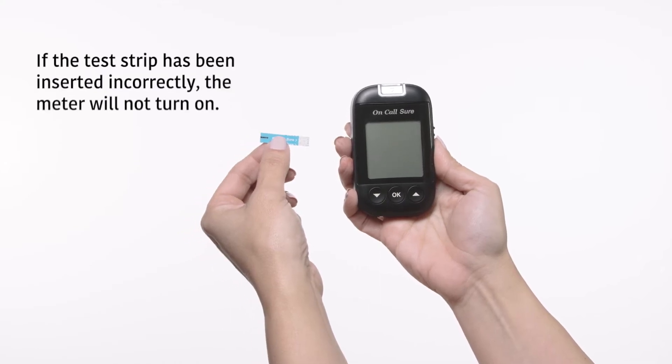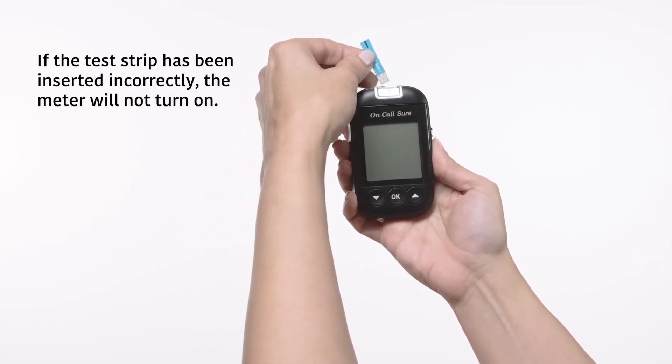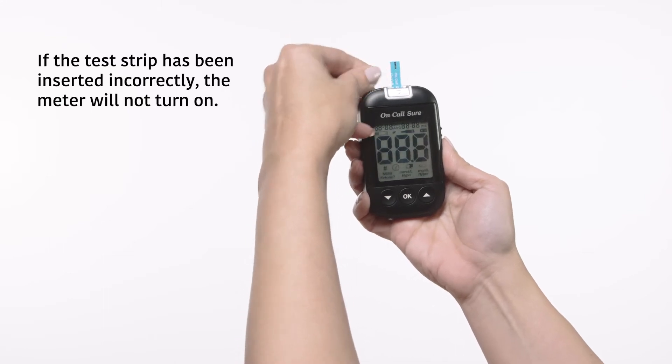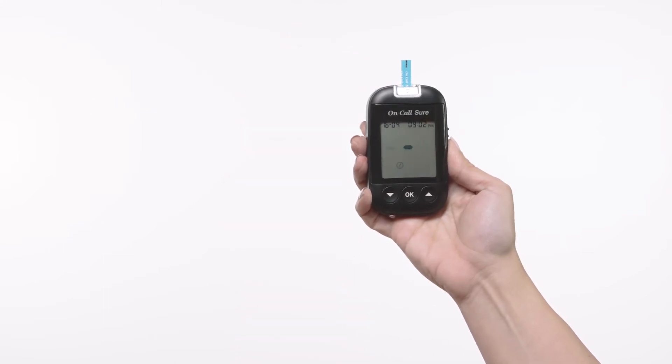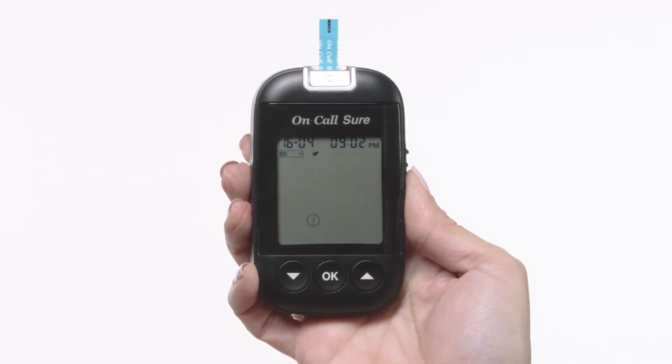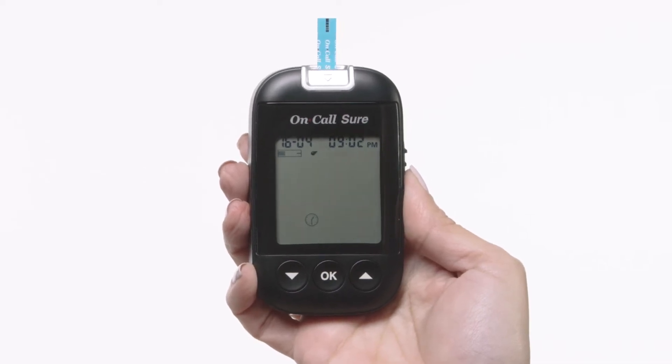Insert a test strip into the strip port, contact bars end first and facing up, to turn on the meter and display all the display segments. Following this display check, the system will enter the test mode. The display will show the date and time and the strip icon with the blood sample icon blinking to indicate that the test strip is inserted correctly and a drop of blood can be added.